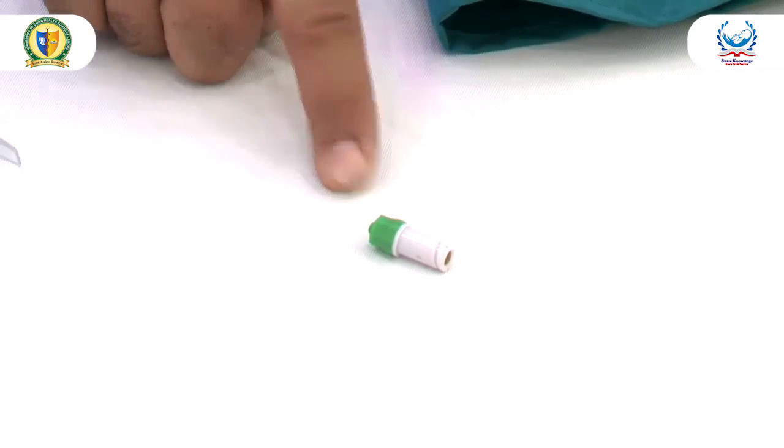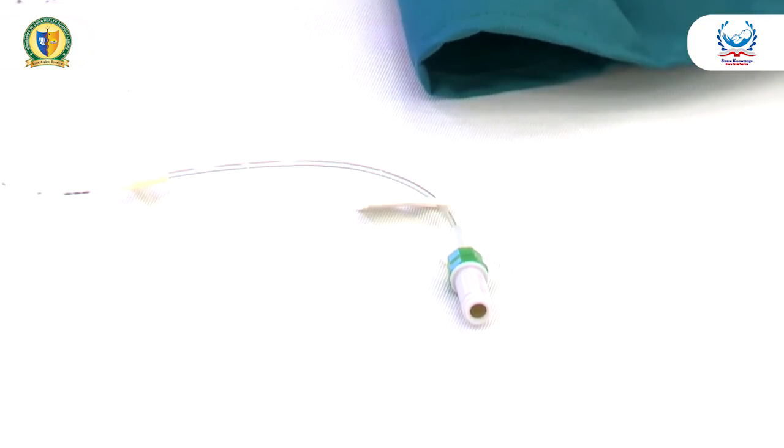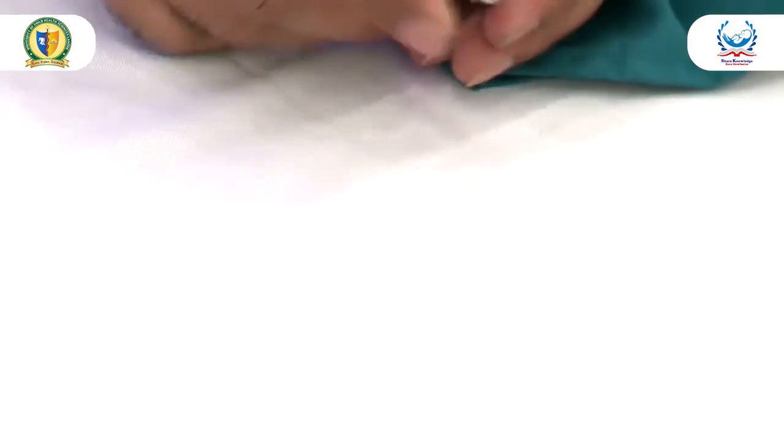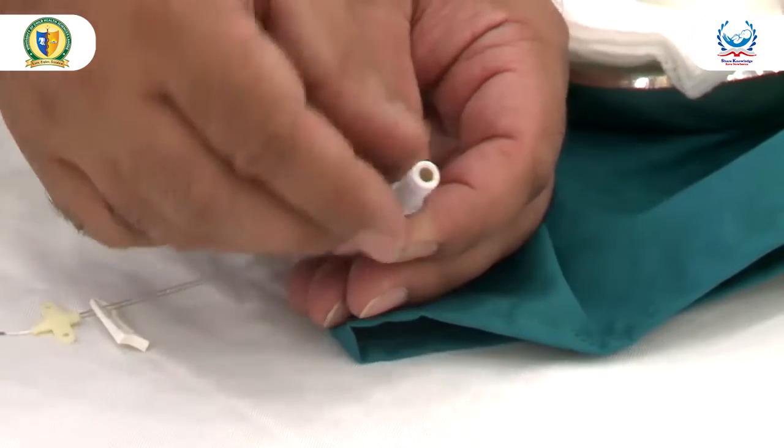Yeah. So this is a needle-less connector and you see that this is an open hub. If you just put it like this, now it is sealed. You don't have to open it again and again. You just, if you see the tip, it's flat. It has got a special spring inside and syringe.